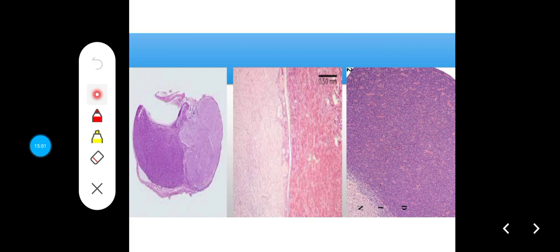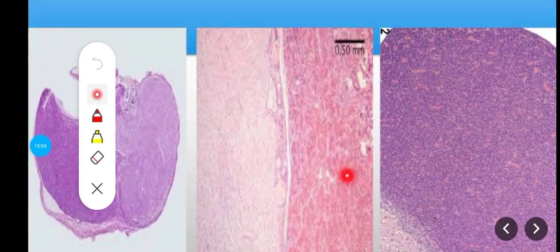Now, the same thing, you can appreciate the image here. You can see a well and uniformly staining area, and then a sharp, poor staining demarcation that doesn't take up the stain, and then a lighter staining area. So this is how you note the pituitary gland.